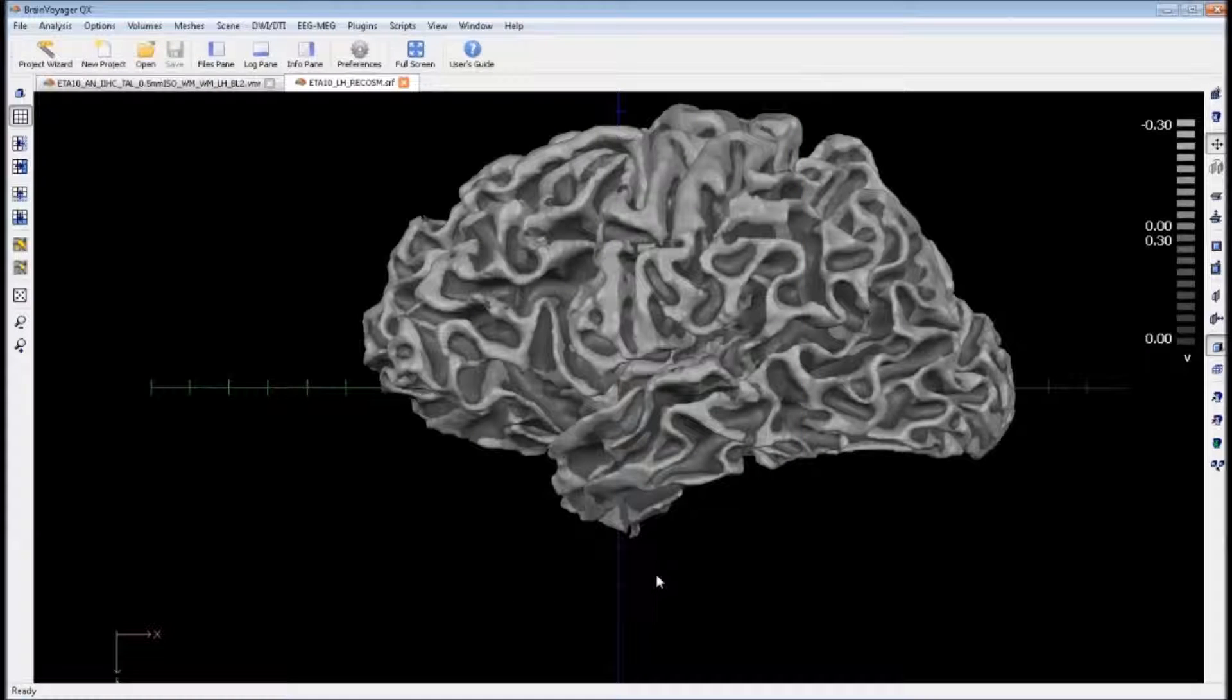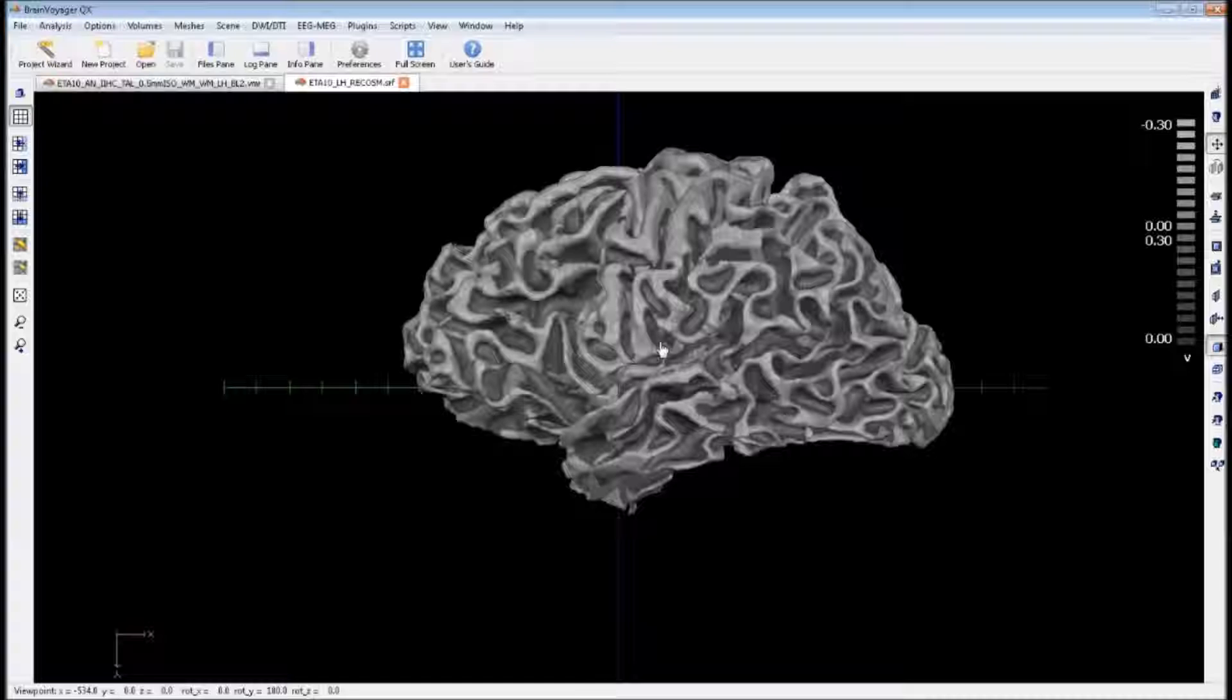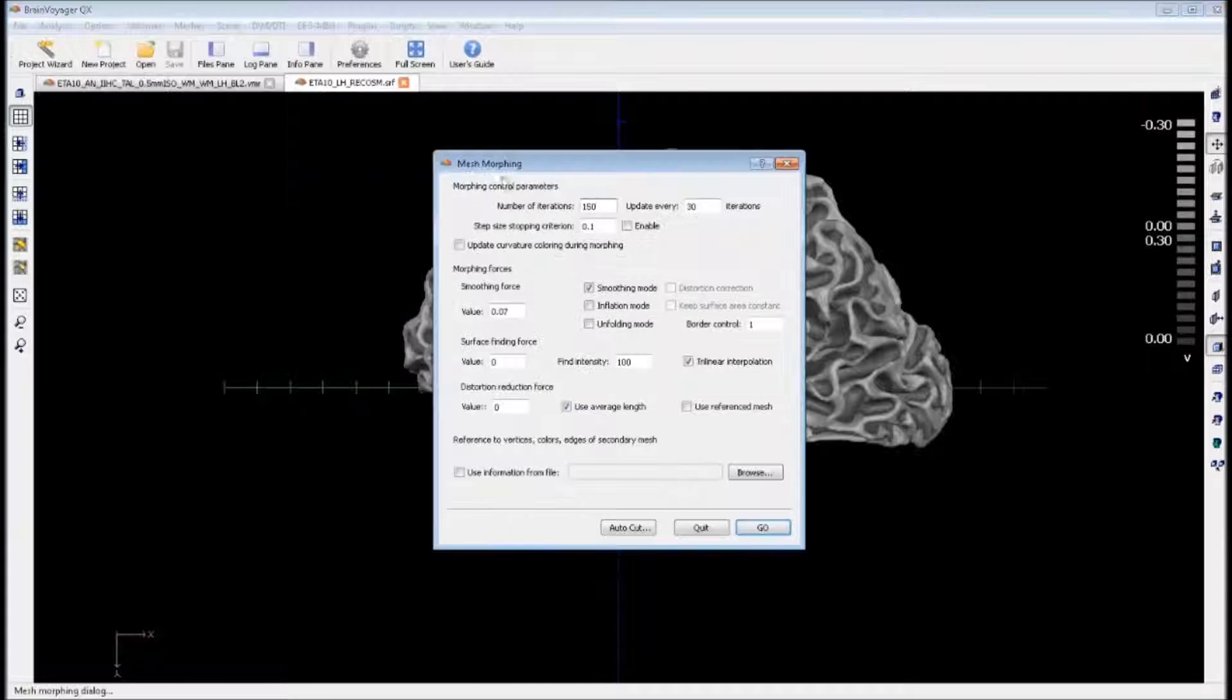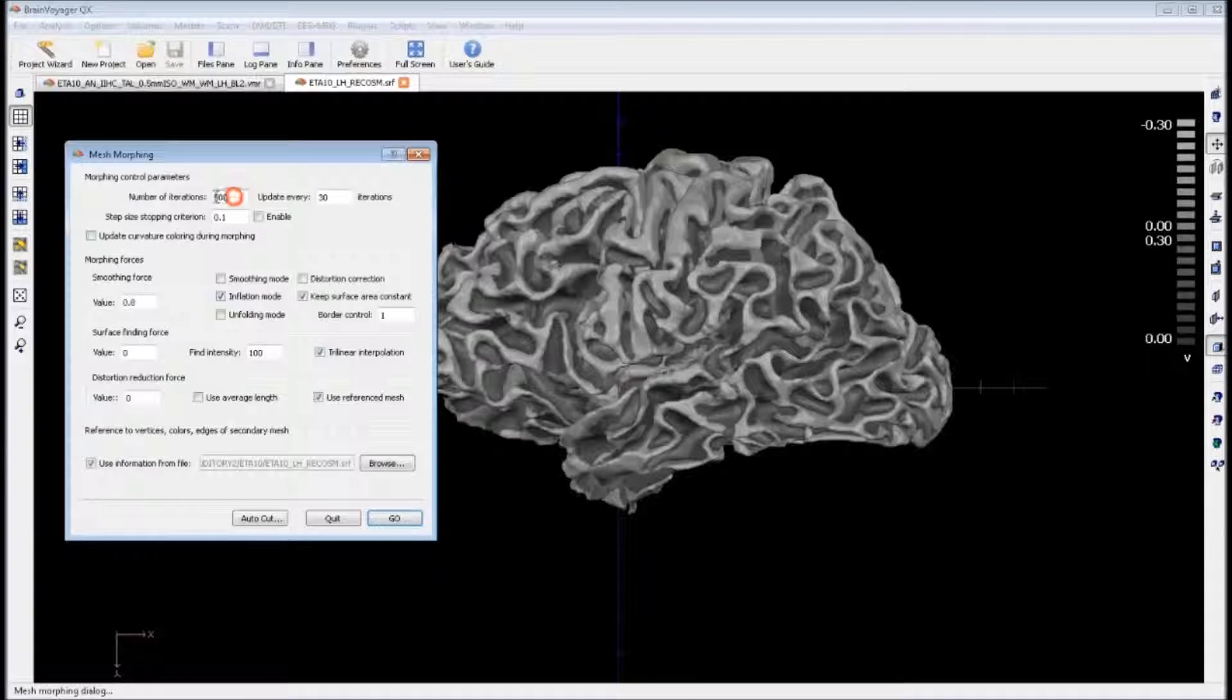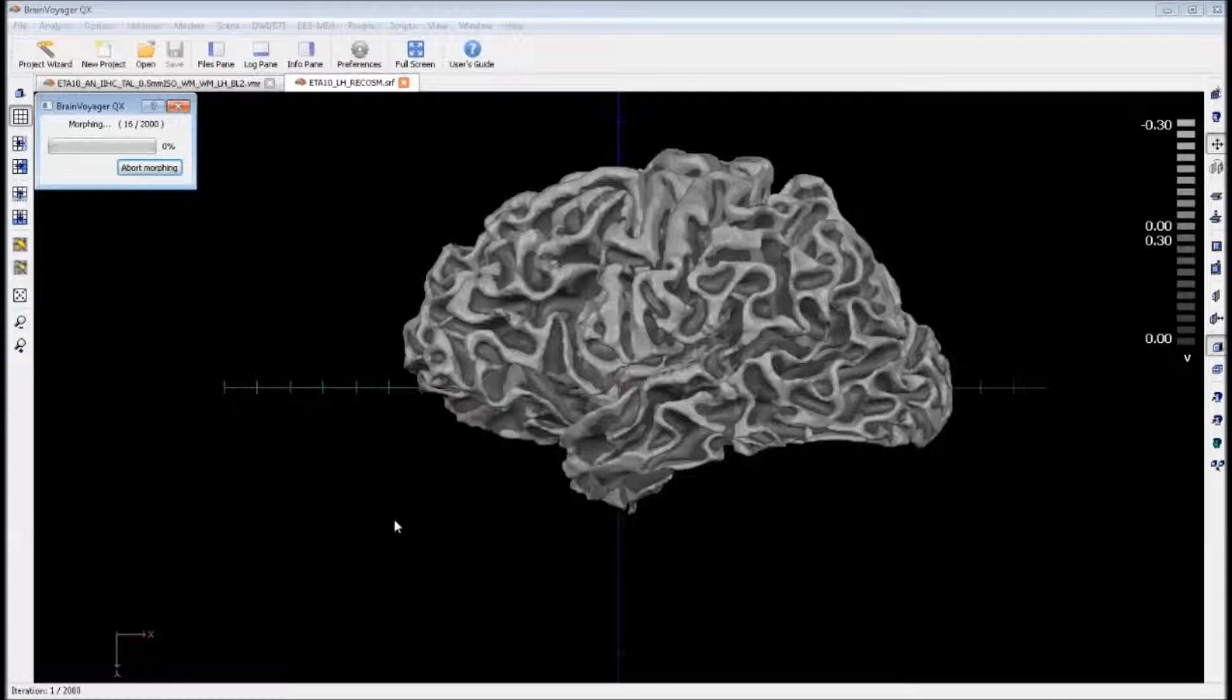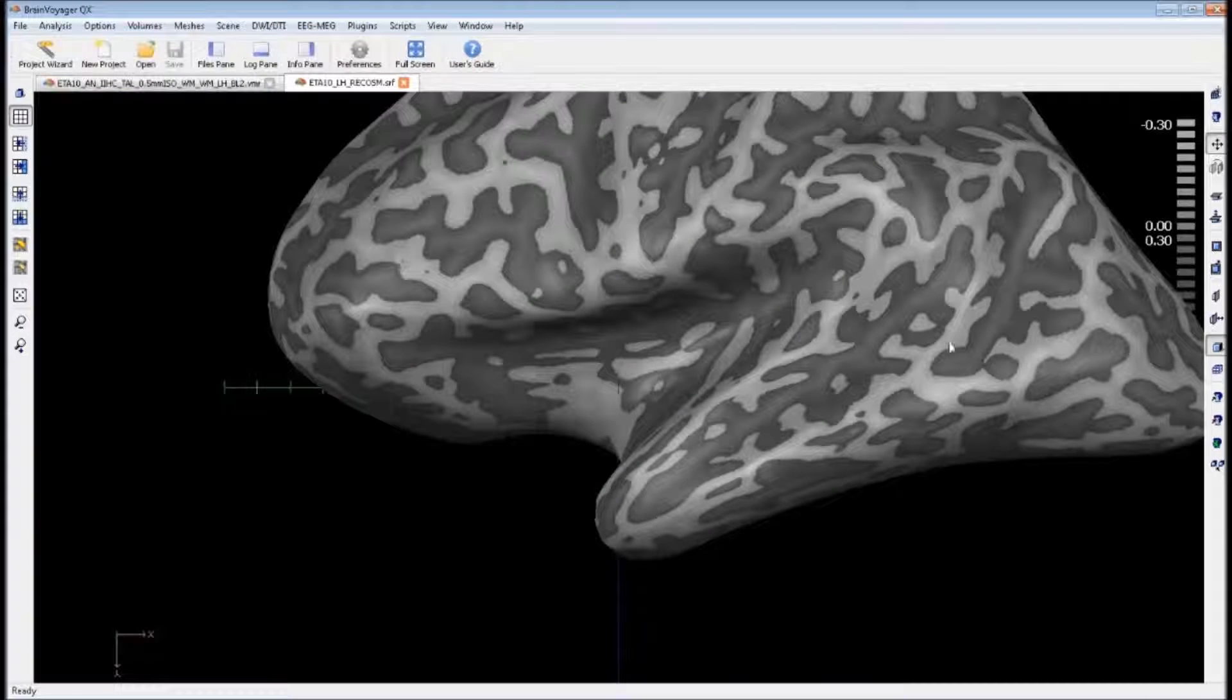The next step is we want to inflate this mesh. We can zoom out a little bit, go to meshes, mesh morphing and click on the inflation mode. The number of iterations we need for this high resolution mesh is about 2000. Once it's complete, it will look a little like this.